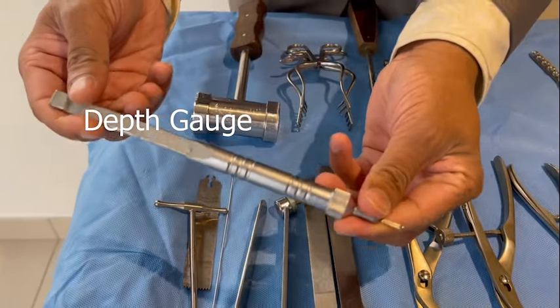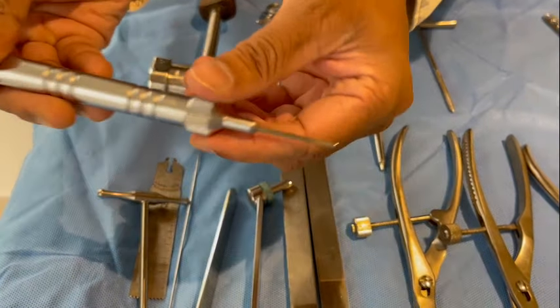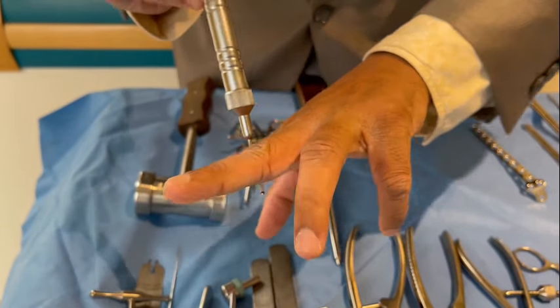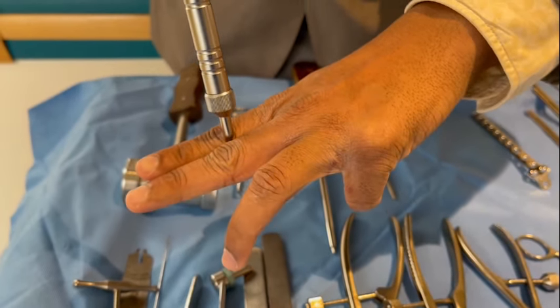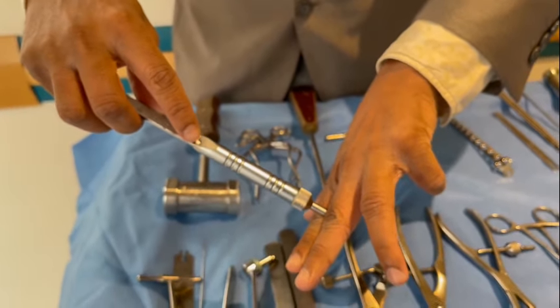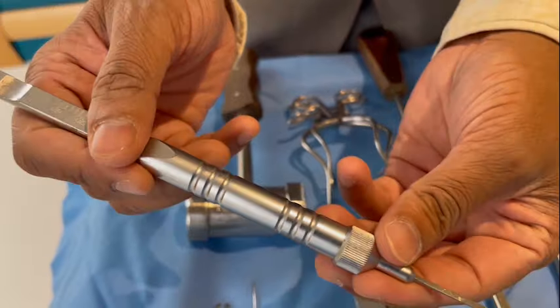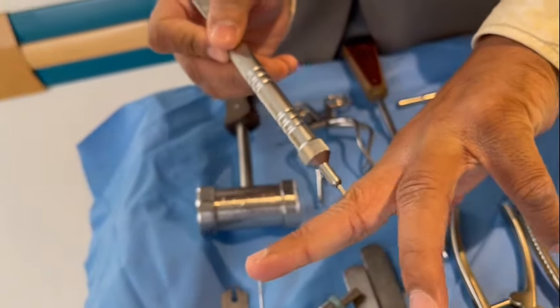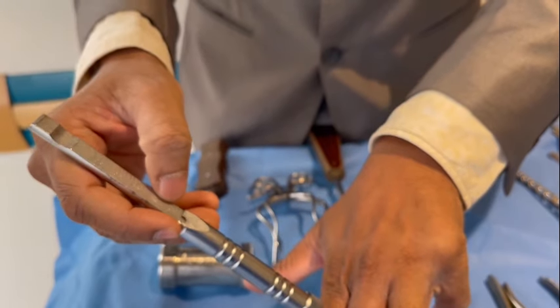This is a depth gauge. There is a small hook on the tip of the depth gauge. After making the drill hole, you put the depth gauge through the drill hole, hook it on the under surface of the bone, and then push the upper part. Once done, you have a measurement indicating the length of the screw that you need to use. The hook on the tip allows you to go through the drill hole, hook on the under surface of the bone, push this part, and get a measurement of the screw length.